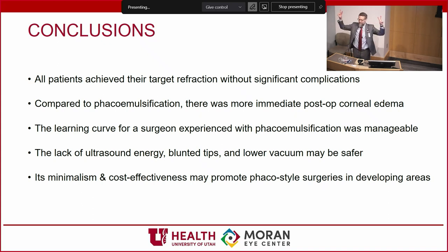Dr. Selak has a comment. Oh, Brian, go ahead. System disposable or reusable? The portions that are reusable, this motor itself is reusable, re-sterilizable.